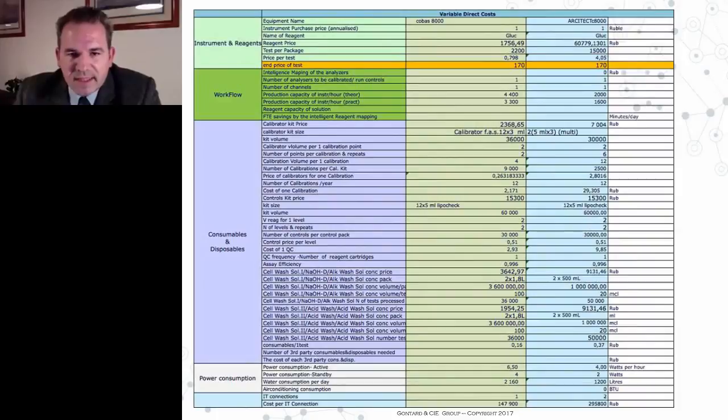So this is the second part, still for the same assay, where we calculated and we documented. And what you see here is calculated data from the big mass of data that we extracted. So we have 46 such spreadsheets for the study. Each assay has its own spreadsheet, and you will see at the end, I will show you the statistical cohort that we integrated. We have about 6.5 million data points in this study for the 46 assays.